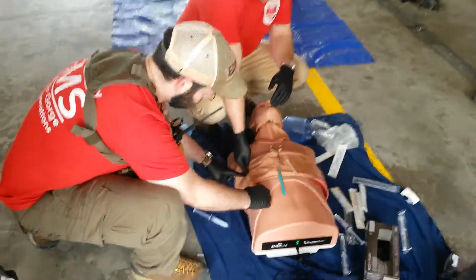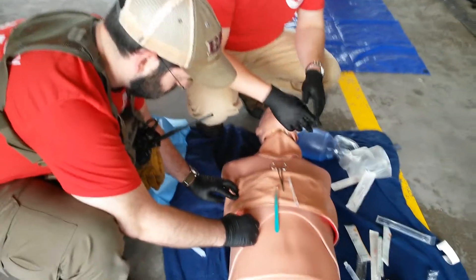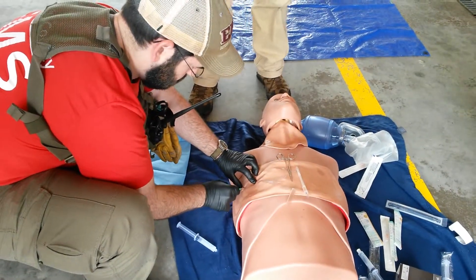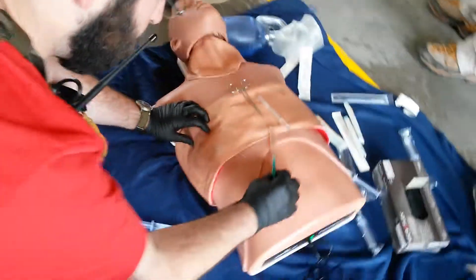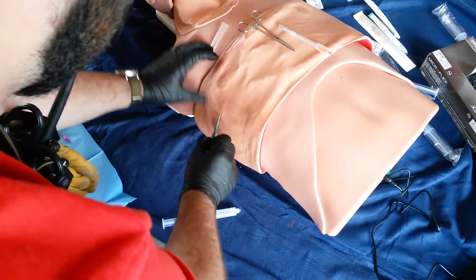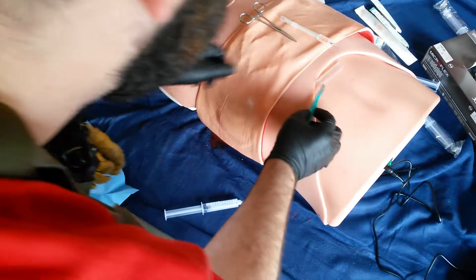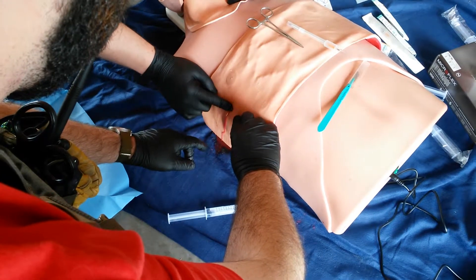If that's what you think is your fourth rib, and you're intending to go in that space, go over top and make your cut over top of the fifth rib, along the axis of the fifth rib. And you're going to want a big cut here — again, this guy's in cardiac arrest when we're doing it. Everybody tends to err on the small side and make like a one-centimeter-long cut or something like that. If you want a big cut — if it goes from the anterior axillary line to the mid-axillary line — don't be afraid to really slice. Don't be afraid to make a big hole.